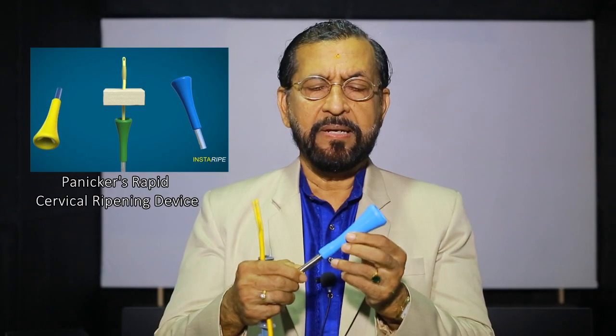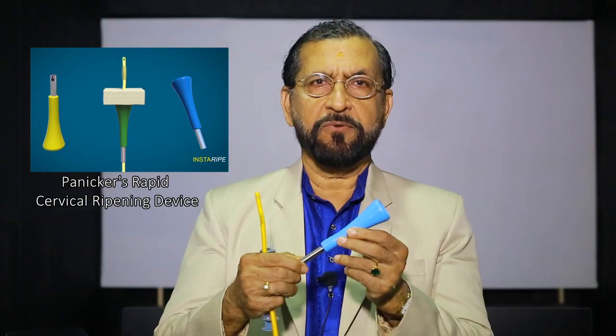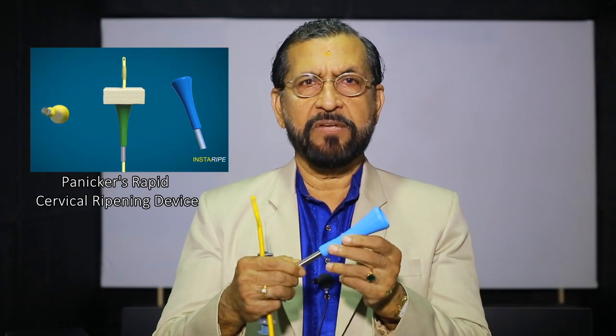This is the soft, silicone, autoclavable, rapid cervical ripening device invented by me. This can be used along with a Foley catheter to ripen the cervix very fast.